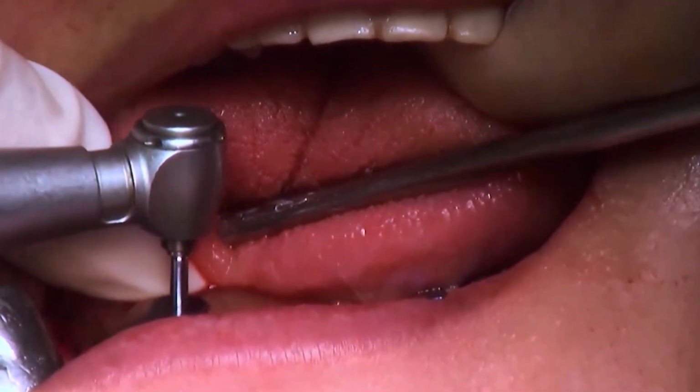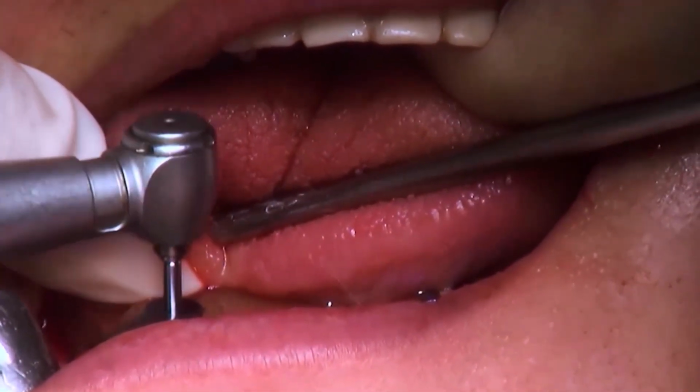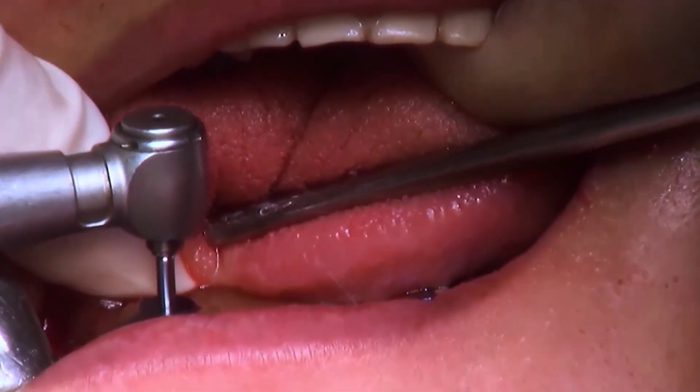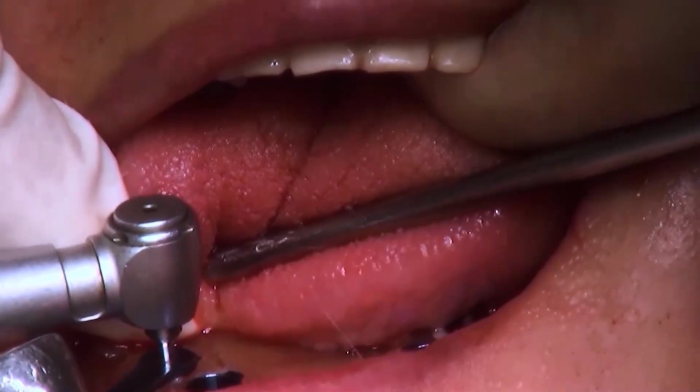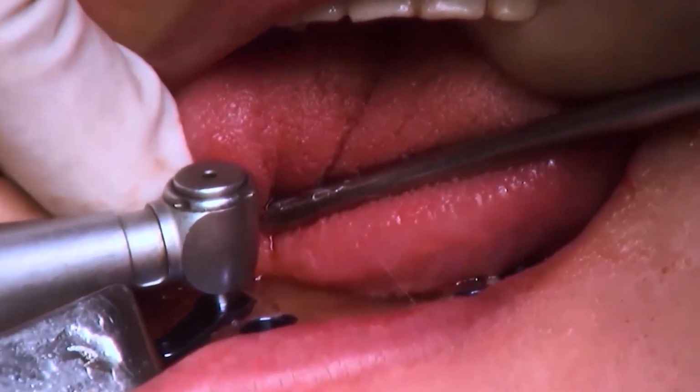You can see here, prior to rotating, I tried to get a sense of direction. After getting a sense of direction, I started drilling.